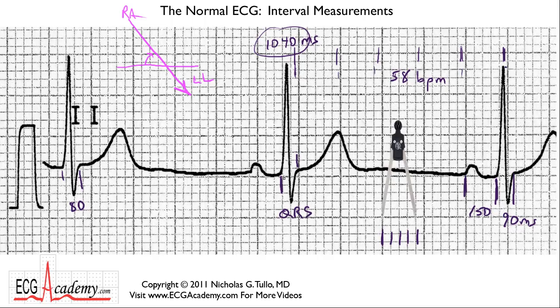For the QT interval, since it starts on a light line, count off: 40, 80, 120, 160, 200, then another 40, 80, 120, 160 — it comes right back to baseline at 200 plus 160, which equals 360 milliseconds. That's the QT interval.